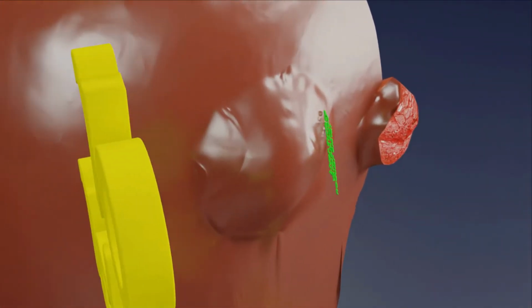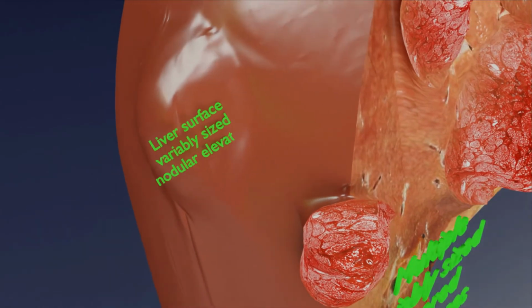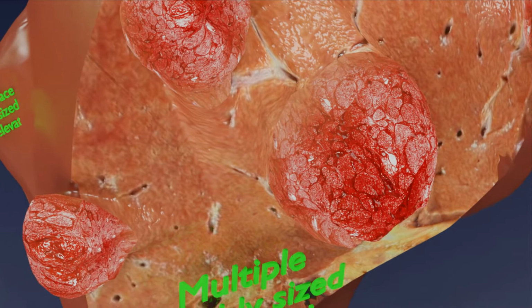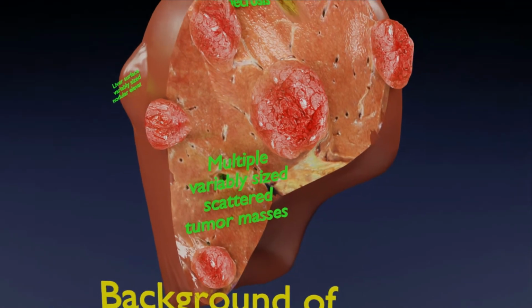Thirdly, the demonstration of alpha fetoprotein, that is AFP, in tumor cells or in the blood is almost diagnostic of primary hepatocellular carcinoma. The last point is invasion of hepatic veins. If present, it favors primary hepatocellular carcinoma.